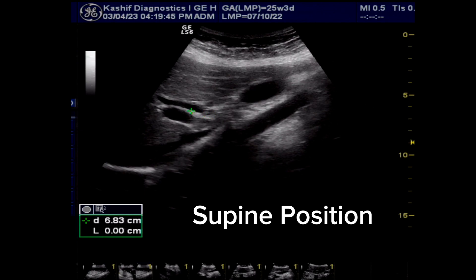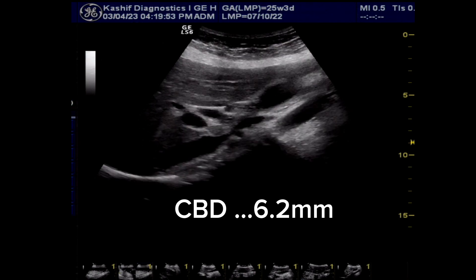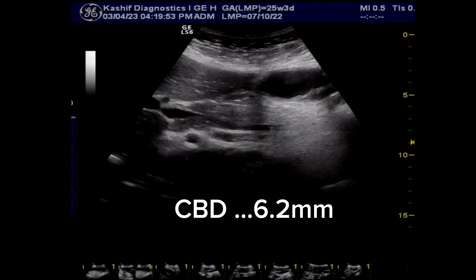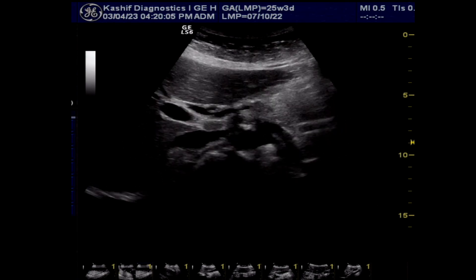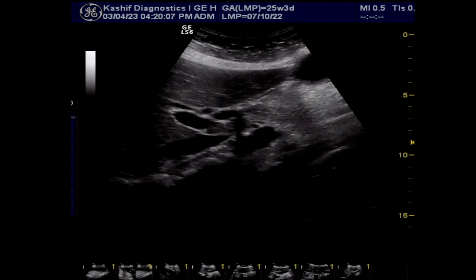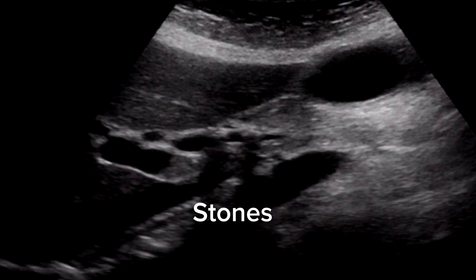The patient is now turned to the supine position. This gives a clearer view of the CBD, which measures 6.2mm. Further tracing the CBD shows a more clear view with two stones in the mid to distal third of the CBD.